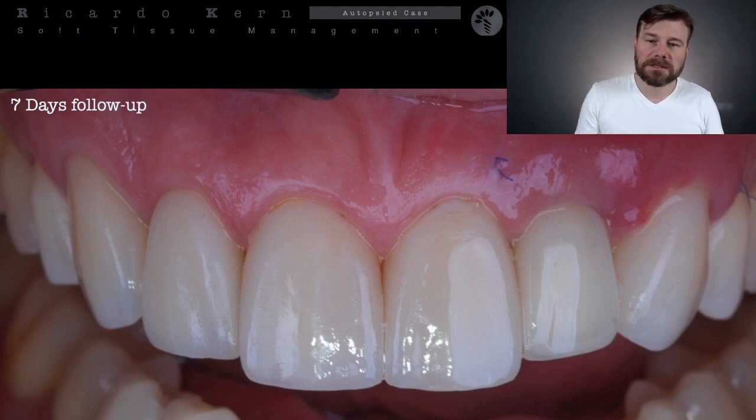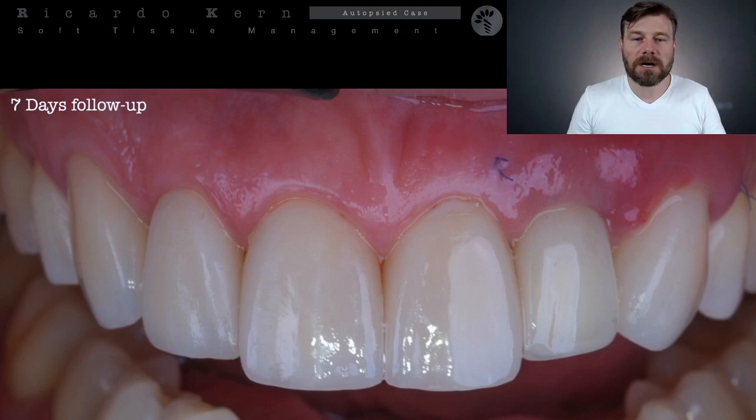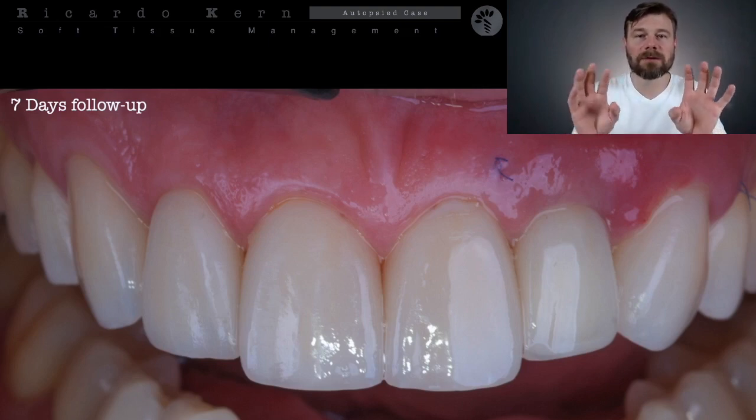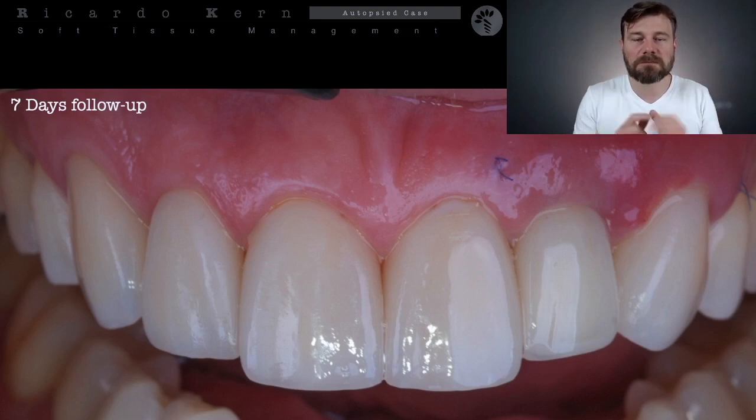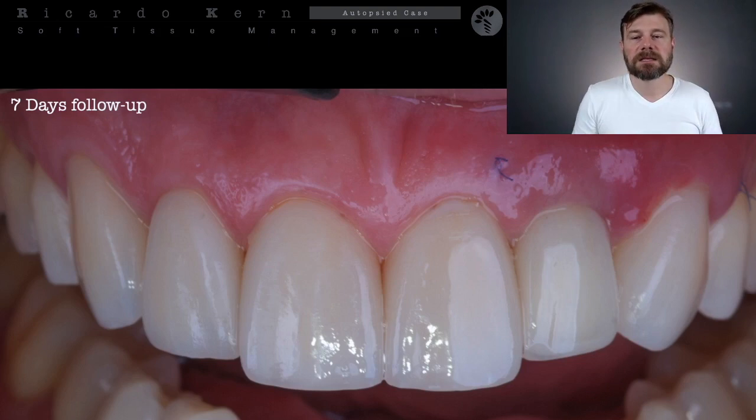After 3 months, the dentist can make a new crown for this patient and probably balance much better the cervical margin between one lateral and the other one. We create a little more excess of tissue, and now the dentist can make a small conditioning and position perfectly the zenith point for this graft.